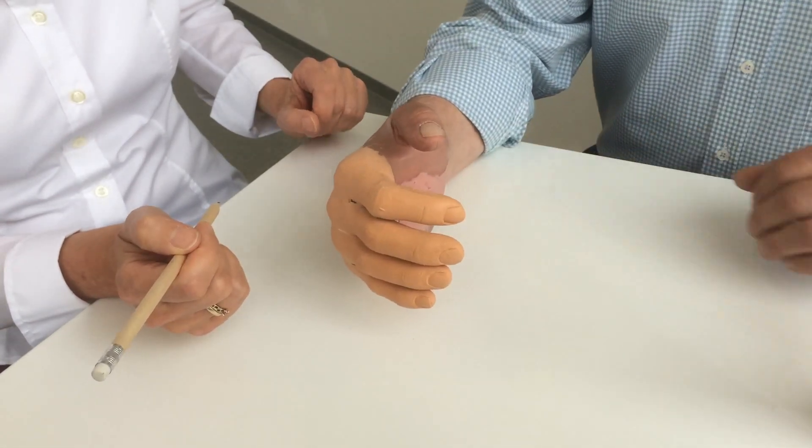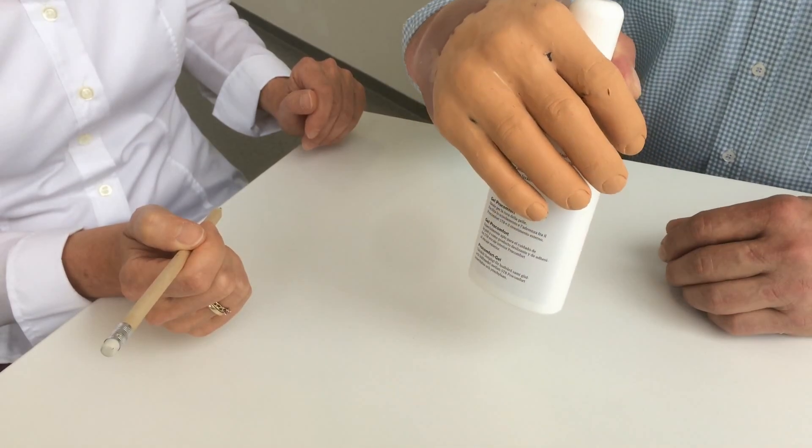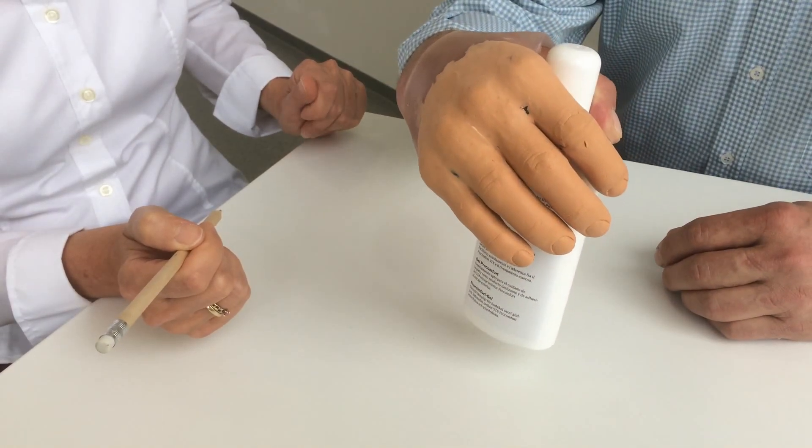Please try to grip the bottle again. Great, now I can grip and hold the bottle better.